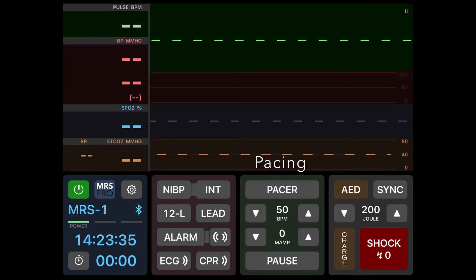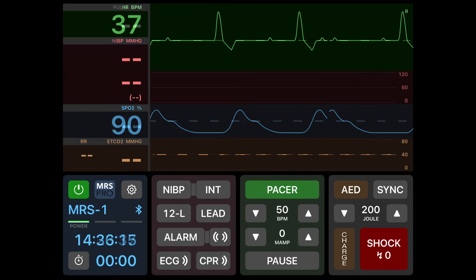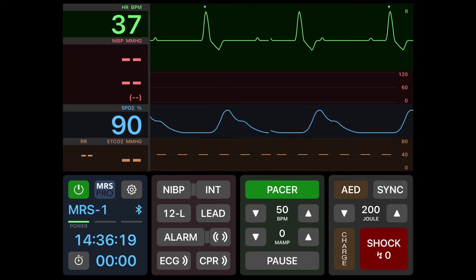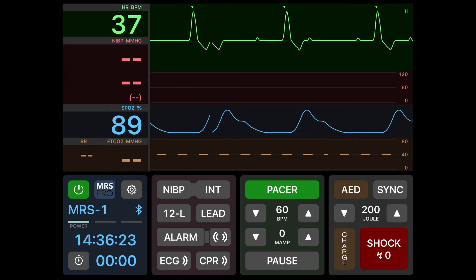To the right of this section is the pacing section. To turn the pacer on, click the pacer button. Here we can see a rhythm that is going to be paced. Once the pacer button is pushed you can see all of the R waves marked at the top of the screen.